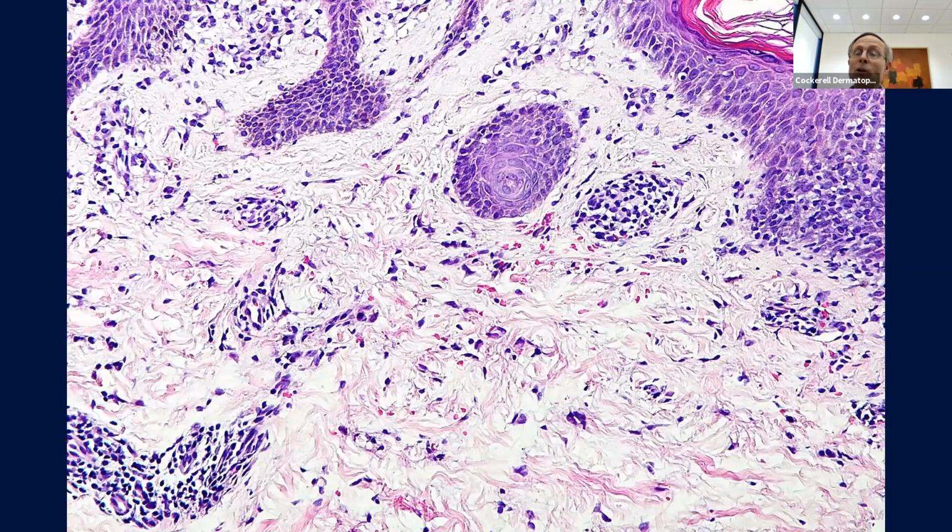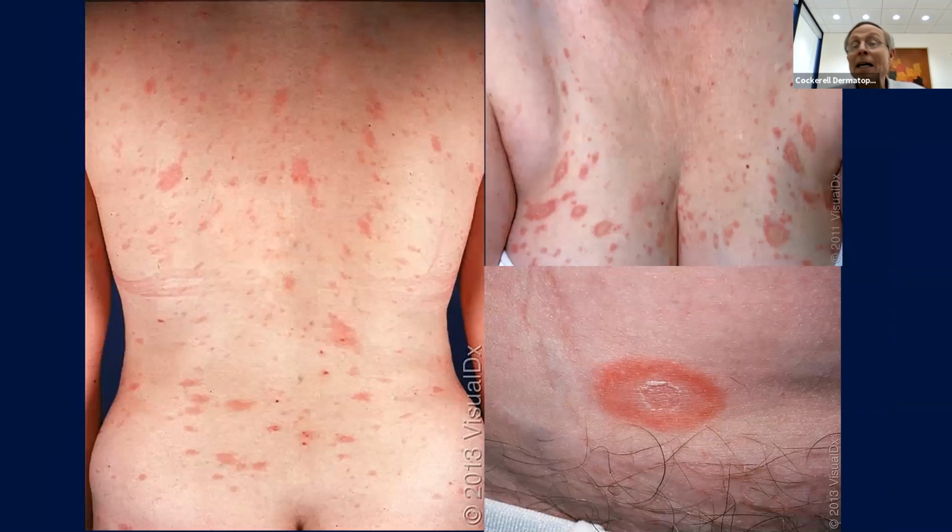It's a little bit difficult because you have to be a good dermatopathologist to know those criteria. And you have to be a good morphologist to be able to recognize and apply the criteria. But they very well could show you that. If they show you this, it's almost an insult to your intelligence because everyone in the world that knows anything about dermatology should be able to know this diagnosis when you see this.